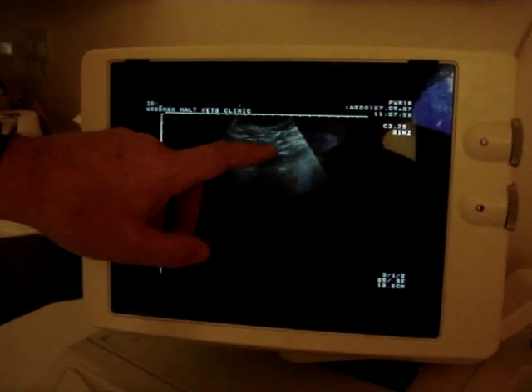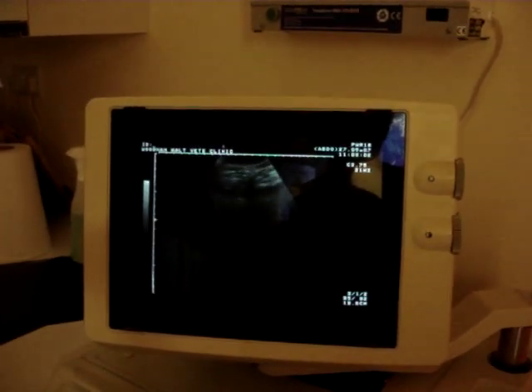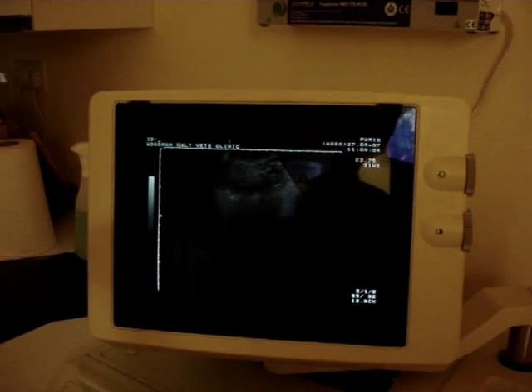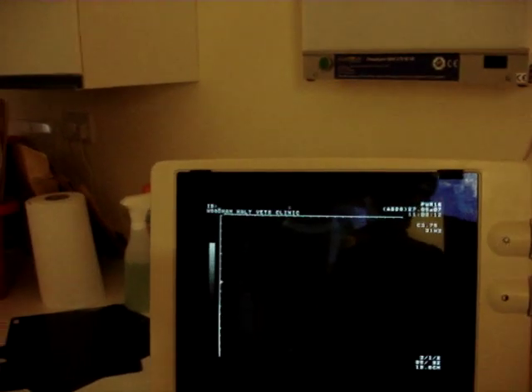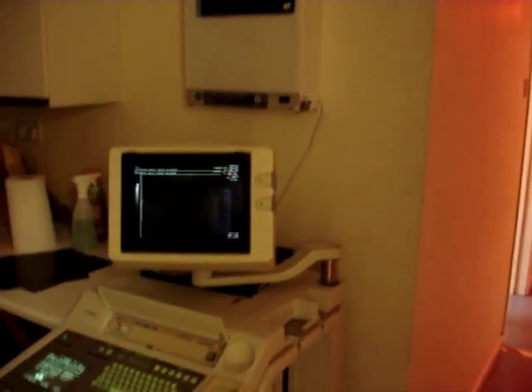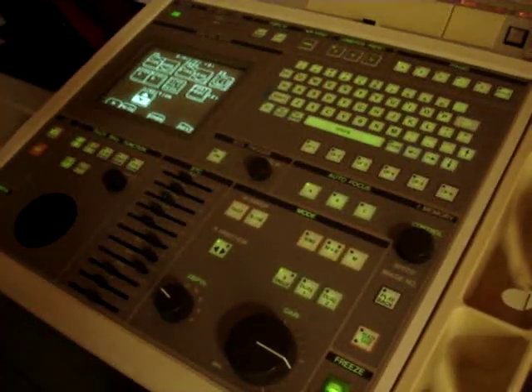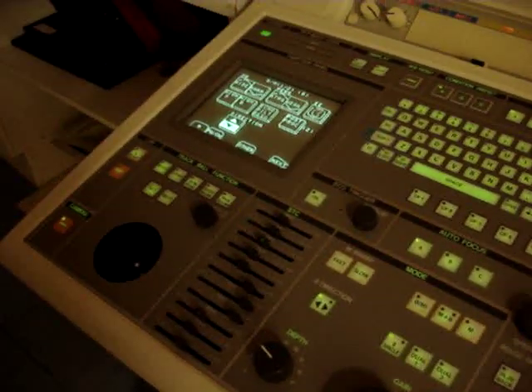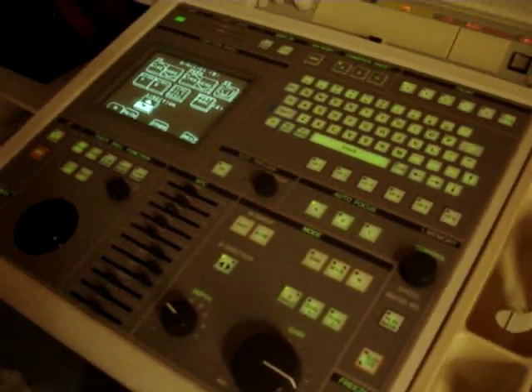There we actually have the blood supply. I'll get a better image of that. I'm strobing a little bit on this but I can still see it. I shall be just looking at the controls here which look fairly straightforward — probably only about two buttons you actually use.